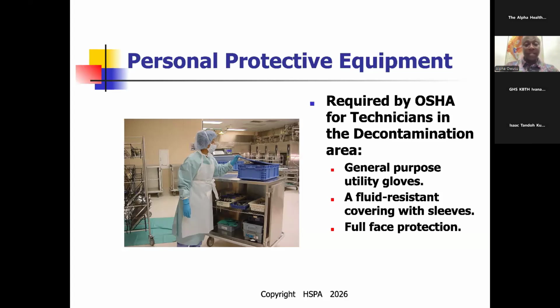Full face protection. I've seen somebody working in decon who did not cover their face well, and then everything splashed in their face. The person went blind. Seriously, you have to get full face protection. Again, consumables, this is very, very important.